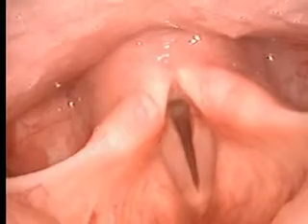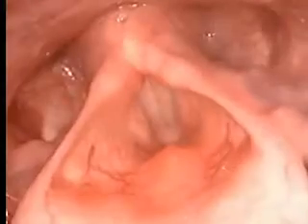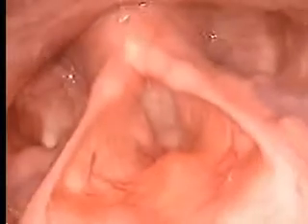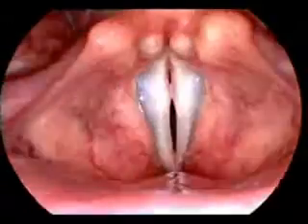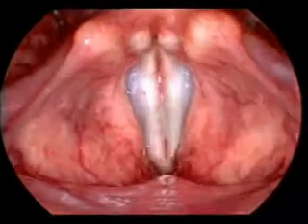Ask the patient to sniff or to inspire deeply through the nose. This causes maximal abduction of the cords, permitting optimal assessment of this important area. Ask the patient to say "ee" or "ah." In the normal patient, the vocal cords will adduct in the middle and come into contact along the entire length, allowing for a precise assessment. During human speech, a vibratory wave is formed as vocal cords produce sounds. Stroboscopic illumination of the larynx can thus reveal subtle alterations of vocal fold vibration.